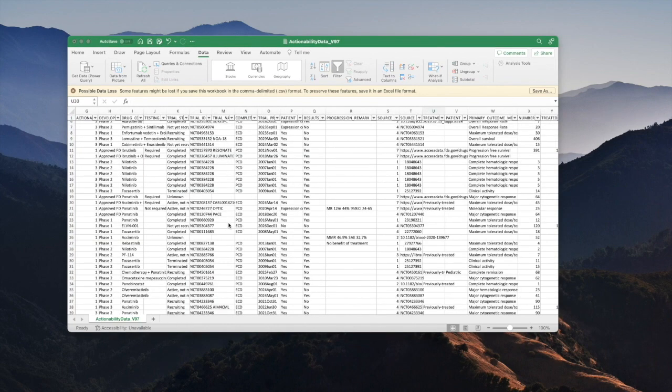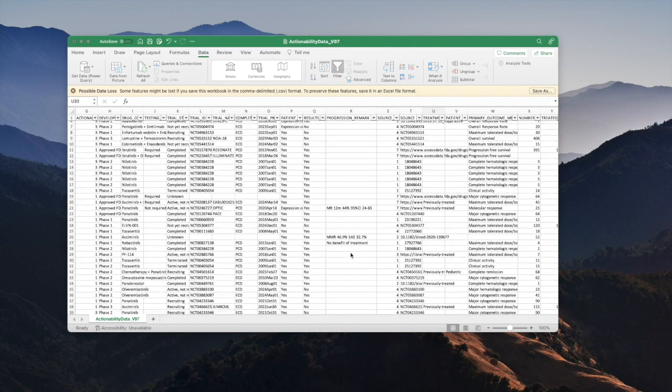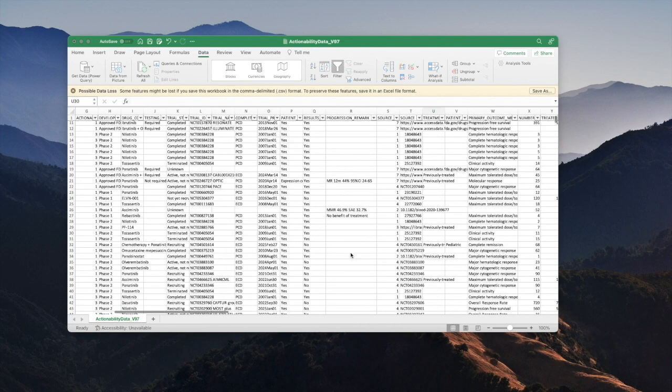The other place that results can be recorded is in this progression remark column. This column is used for results that are less common and consequently don't have their own dedicated results column.